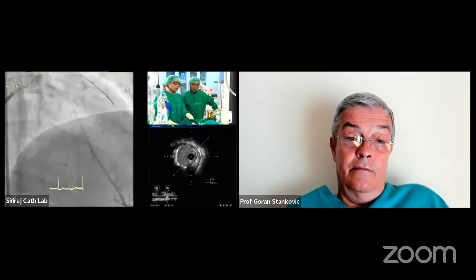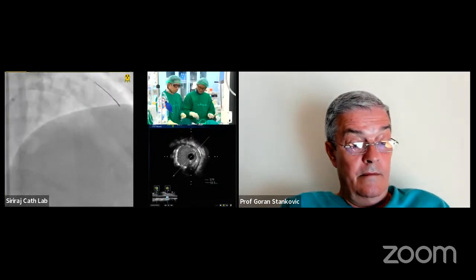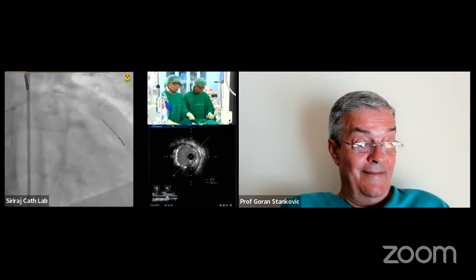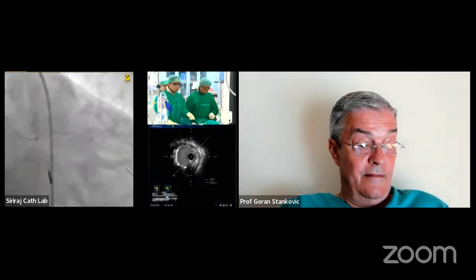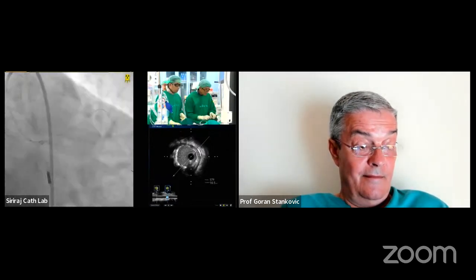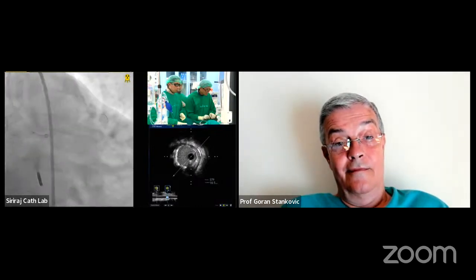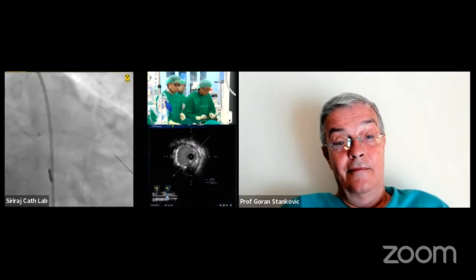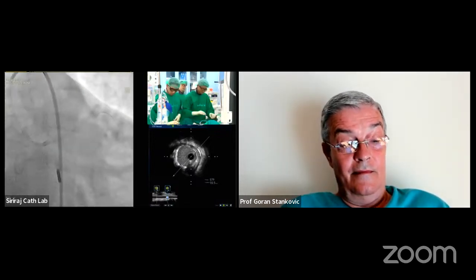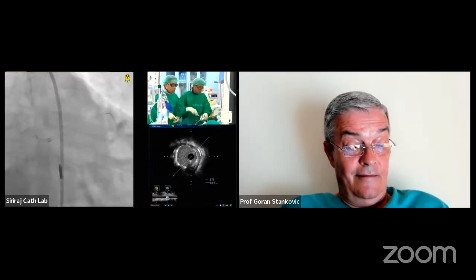So Nattawut, we're going to leave you here for you to tell us what you're going to do later. We're going to break off for a few minutes to have Aaron do his lecture first. We'll give you some peace and quiet, but so far so good. I think you tackled the main lesion. The patient is still very stable. I think the left main result looks very, very good. I agree, Goran. I actually favor just leaving the circ alone at the moment and not investing too much metal there and ending up with too many issues. So we're going to break off and we'll have you stop sharing the cath lab and we'll go to Aaron. Aaron, please.